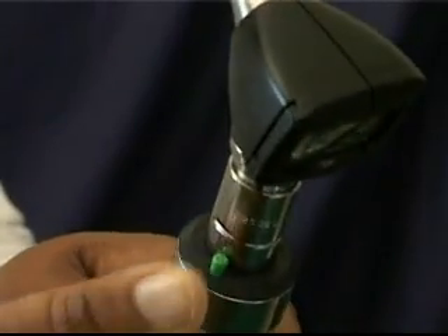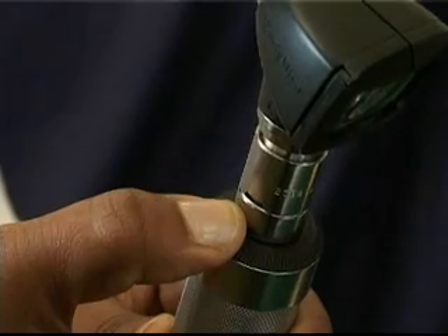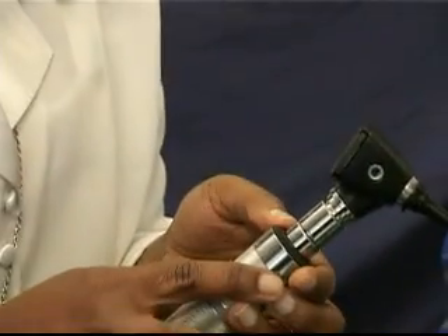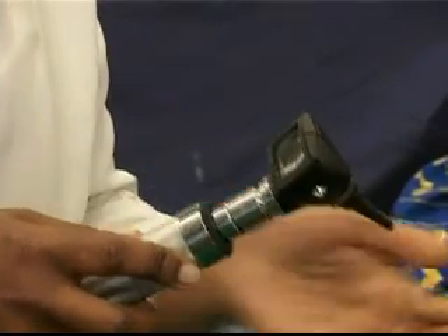Depress the small green push switch, which will turn the unit on, and rotate the rheostat to establish the level of brightness you wish to use. For an aural or nasal examination, the rheostat would generally be on full brightness to ensure a complete and thorough examination of the ear canal.